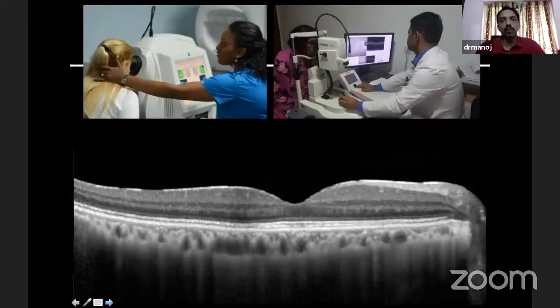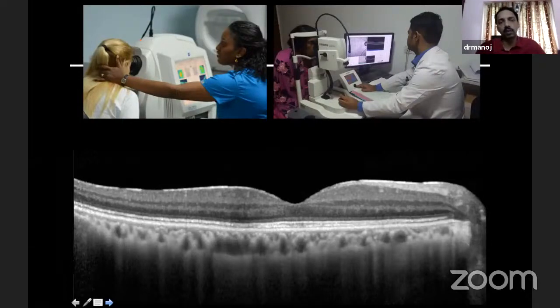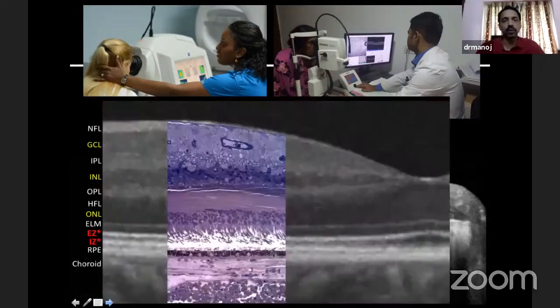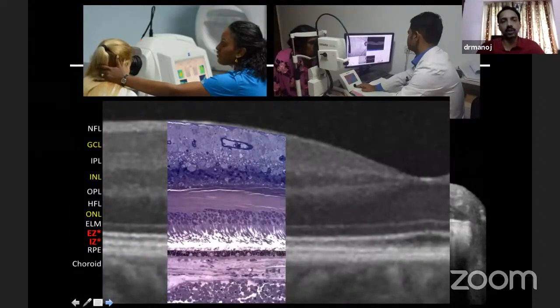This is how we perform the OCT. It's a non-invasive test — within minutes you get a wonderful cross-section of the retina, which is very close to what you see in histology. That's a great thing about this non-invasive test.